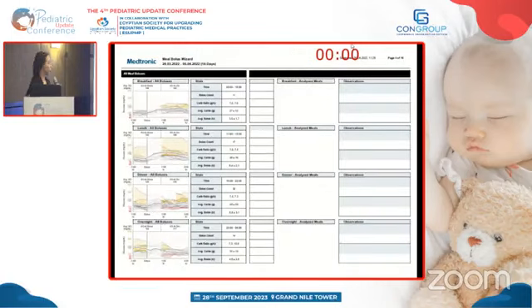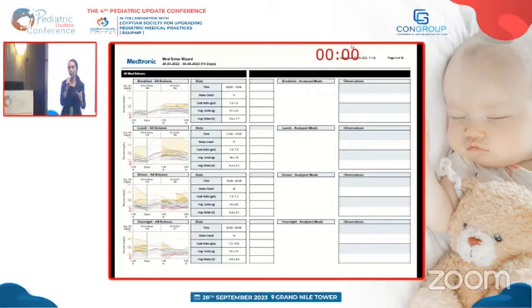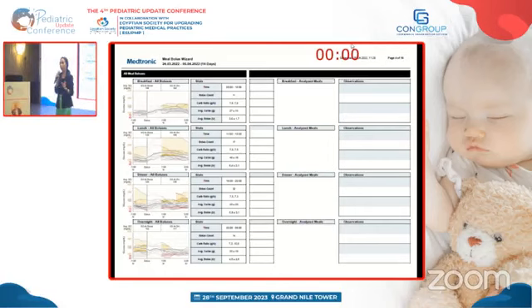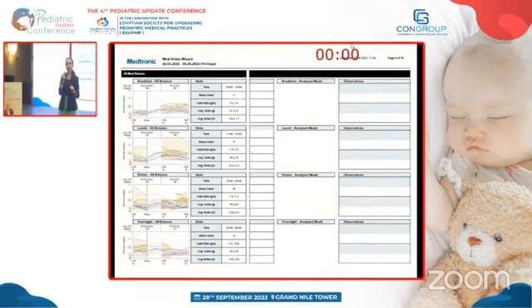طيب هنا تاني ريبورت عندي بيقول لي الميل بولس ويزرد. ميزة الريبورت ده إنه بيقول لي في أي إيفنتس البيشنت. أنا بسلكت من الأول بقول للسيستم إن الفطار بتاعه الفترة بتاعته من الساعة كام للساعة كام، اللانش بتاعه والدينر بتاعه. فهبدأ هنا في الريبورت بيقول لي ساعة من قبل الوجبة السكر بيبقى عامل إزاي، أب تو 3 ساعات بعدها السكر عامل إزاي. ده هنا عشان بيقول لي كذا حاجة.